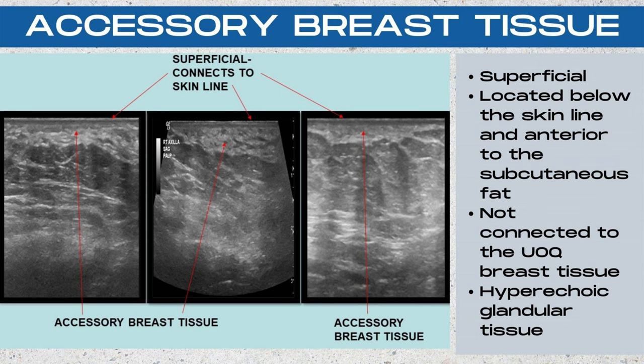Here are three ultrasound images demonstrating the appearance of accessory breast tissue. This is going to be hyperechoic glandular tissue — a patch of tissue that's off by itself. It is not going to be contiguous with or connected to the upper outer quadrant breast tissue. It's going to be located very superficially on the ultrasound image, just below the skin line and anterior to the subcutaneous fat layer.